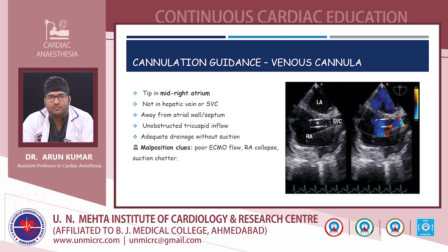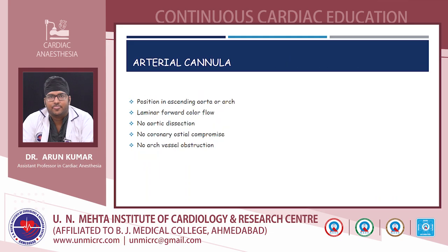This image is a mid-esophageal bicaval view, and it displays the SVC cannula advanced from the IJV, and as you can see, the tip is located in the mid right atrium. And the second image shows after applying the color Doppler.